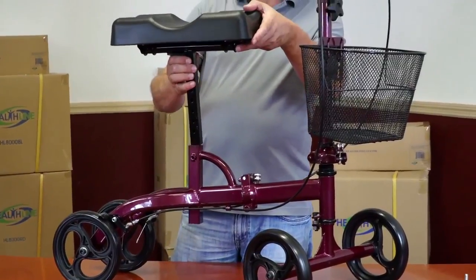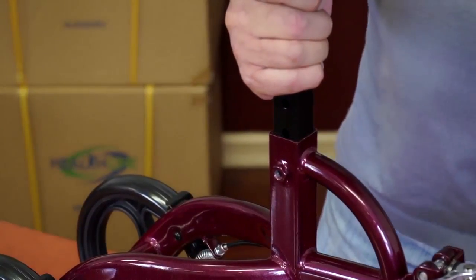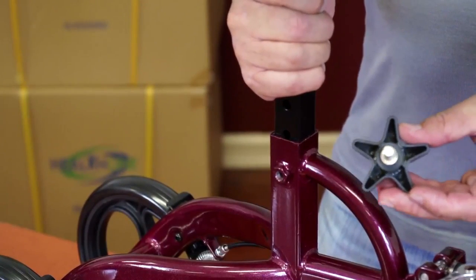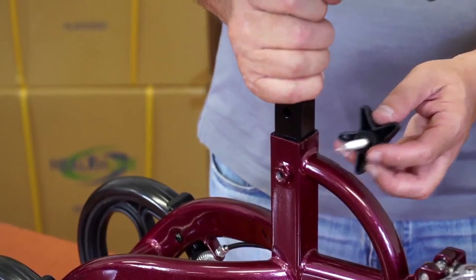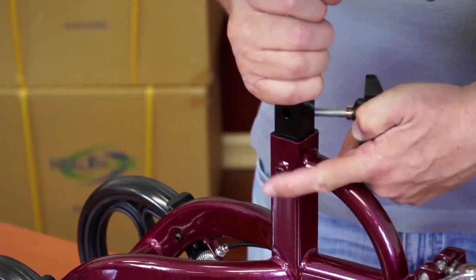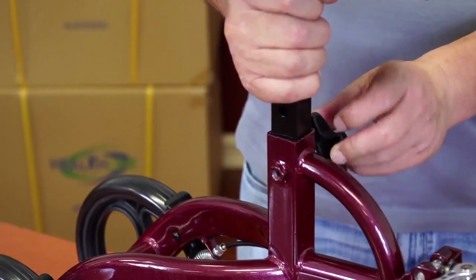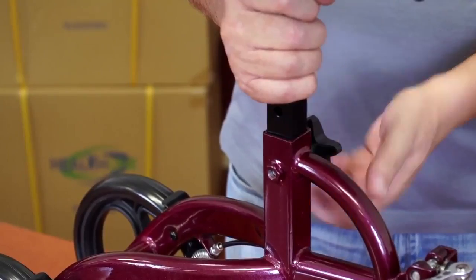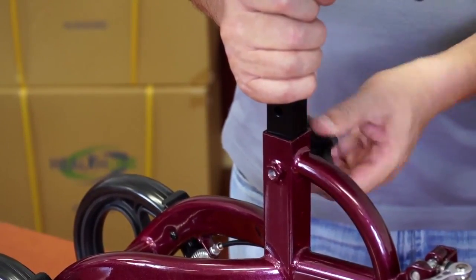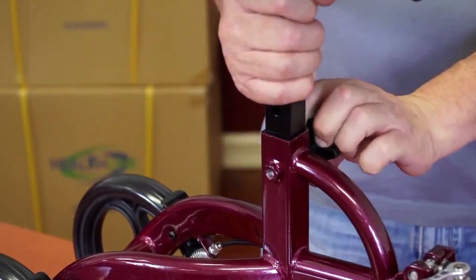Insert the seat post into the seat tube. Align the hole in the tube with the hole in the seat post according to the desired seat height. Feed the large bolt through both holes and screw it into the nut welded to the other side of the tube as seen on the video. The seat is now secured.